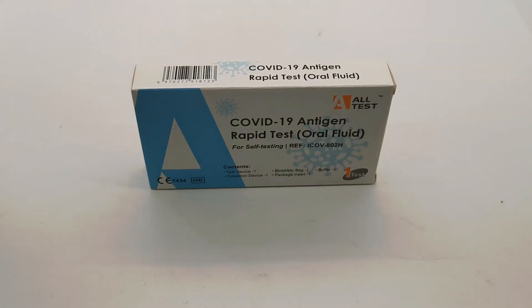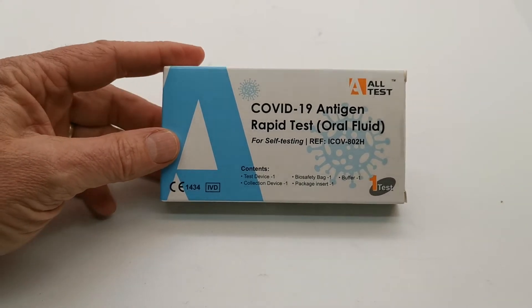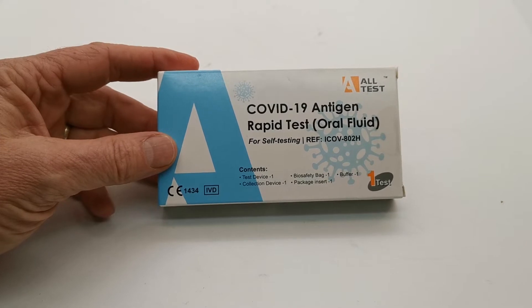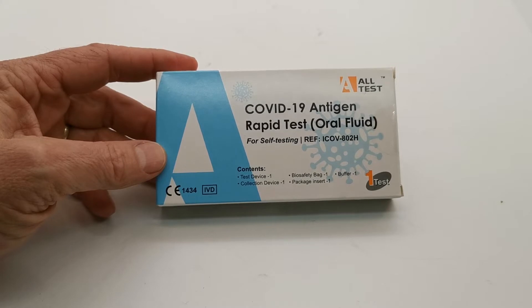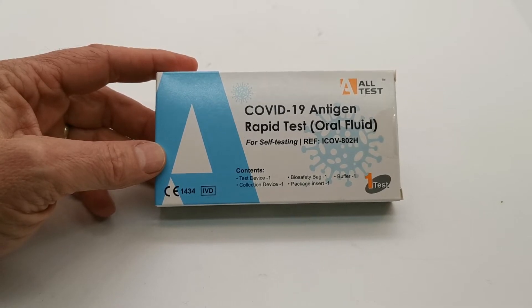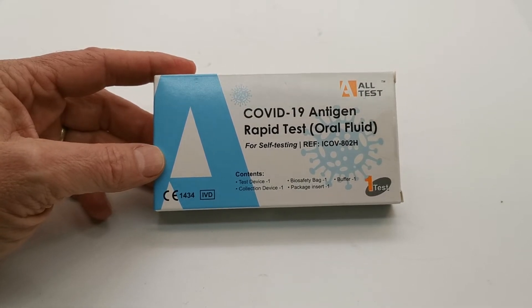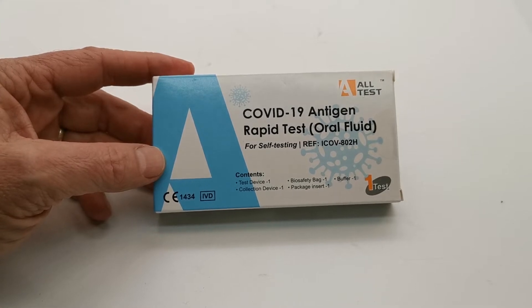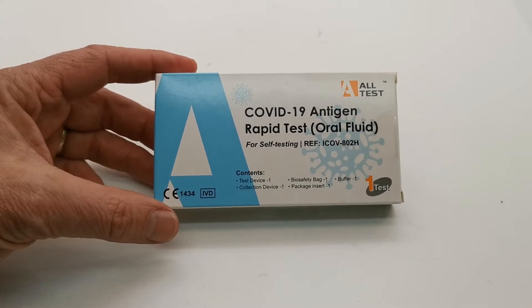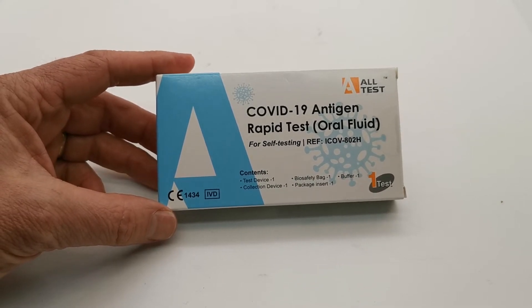Welcome to this Valumed Medical Supply video. We're going to show you the All-Test COVID-19 antigen rapid test. This is an oral fluid test, which varies from a nasal swab or pharyngeal swab test in that it uses oral fluid or saliva to screen for the presence of COVID-19 antigen. Antigen testing detects the actual virus particles on the surface coating, so this is a test for active or current COVID-19 infection.